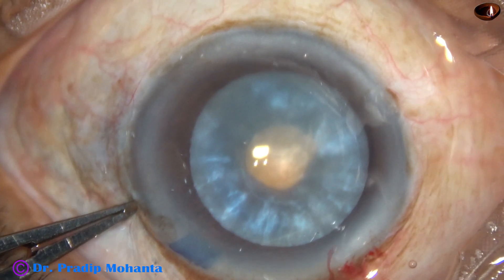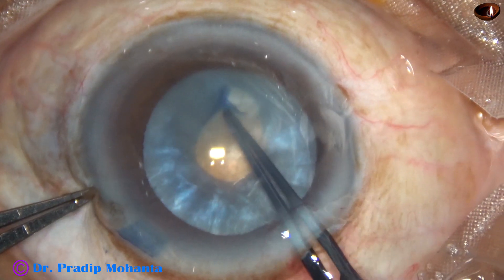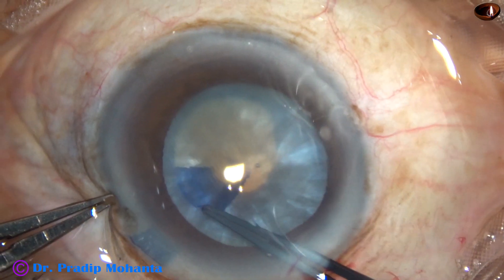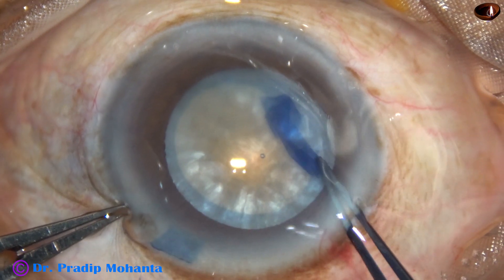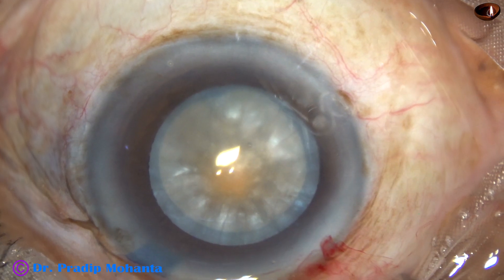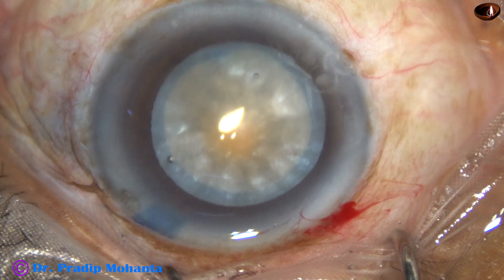Now see how to enlarge this small rhexis into a large rhexis. A small cut is made at 8 o'clock. The tag is made, held with utrata forceps, and we go all around. At this time the capsule will not tend to run to the periphery — it will be very obedient. The rhexis has been completed.